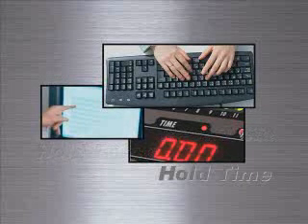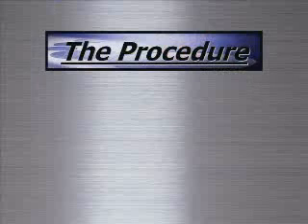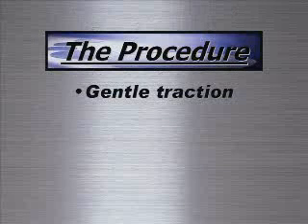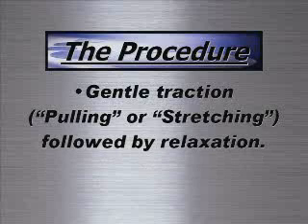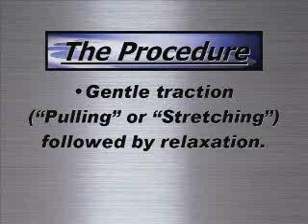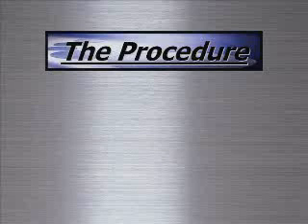When treatment begins, the two harnesses on your body will separate gently and in a controlled manner, stretching and relieving pressure on the targeted area of your spine. The traction unit computer cycles through phases of controlled and gentle traction or pulling, followed by periods of relaxation. And that's really all there is to it.